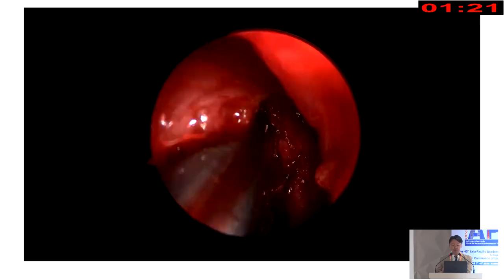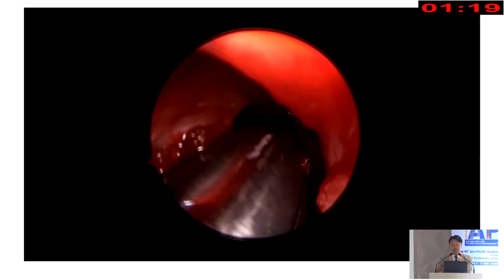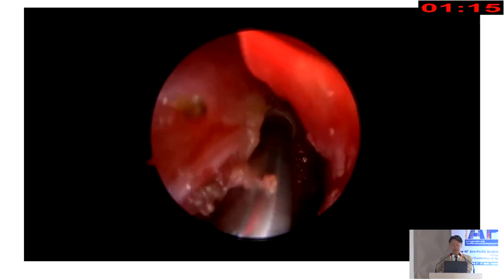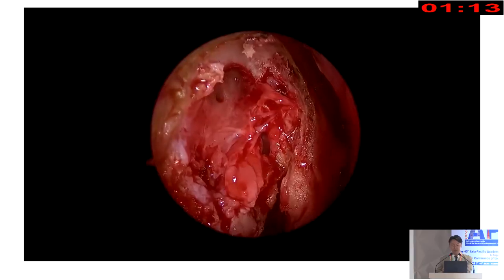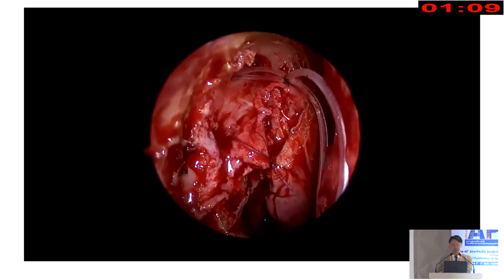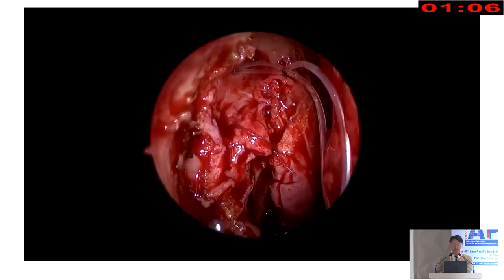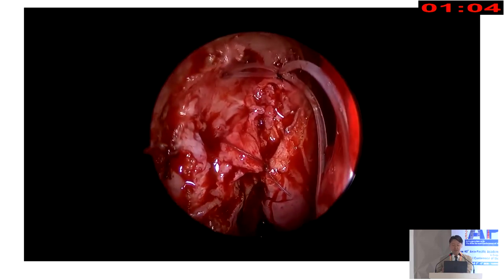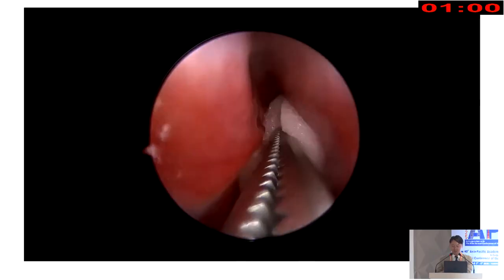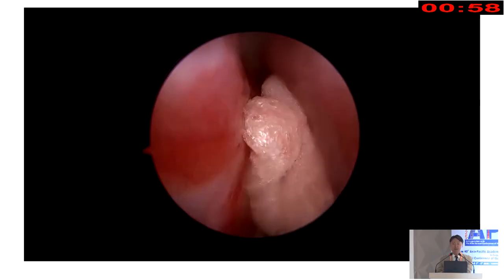The osteotomy site is enlarged superiorly using a Kerrison punch and power drill. After that, you can see the inside of the lacrimal sac as well as the common canalicular opening. A silicone stent is inserted and an inferior flap was made. Lastly, the packing material is inserted, which will be maintained at least 2 weeks to prevent the reformation of the synechia.